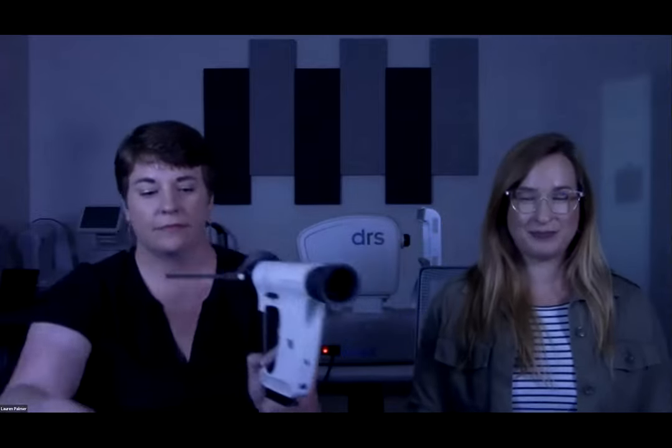Now, if your optic nerve is not on the screen at all, that's when you would start to slide the dot out. If your optic nerve is in the middle of the screen, you would slide the dot closer to the camera. One good tip with these devices: make sure you're pointing out the dot that you want the patient to look at. You can also charge the dot by holding the flashlight on the outside of the dot. It'll start glowing a little bit more.